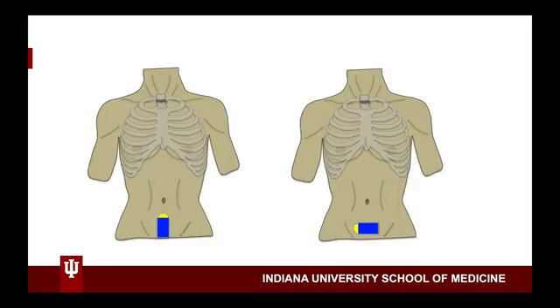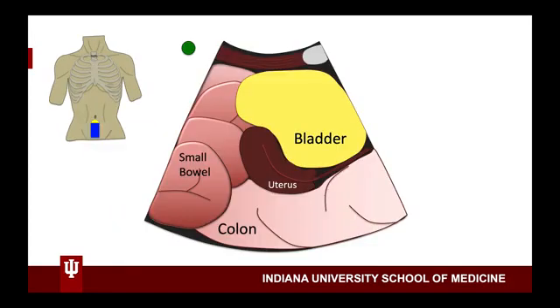To perform the exam, we will find and measure the bladder in the sagittal and transverse orientations. In the sagittal view, with the probe placed just above the pubic symphysis and the marker dot pointed towards the patient's head, you will drag the probe back and forth. Once you have identified the view where the bladder appears the longest, you will freeze the image. With the image frozen, you will be ready to measure the length of the bladder. This is done by selecting the measurement or caliper icon. When measuring, the caliper should be placed just inside the bladder wall.